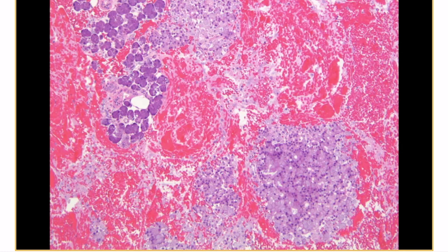So you will have here normal parotid gland on your left side. You can see small ducts. You can see the very organized grape-like architecture. And on your right side, you can clearly see that this is not normal. These are neoplastic cells. They have abundant pink to clear cytoplasm, somewhat granular. And I have the resection for you.